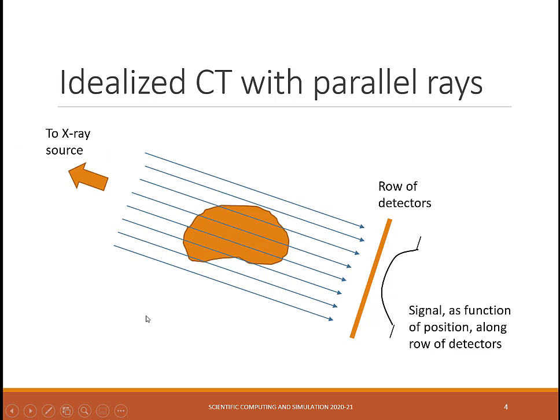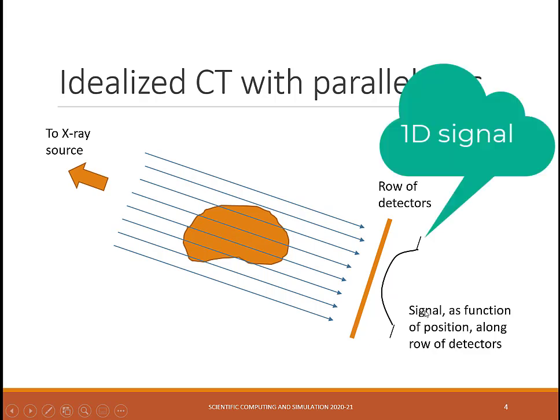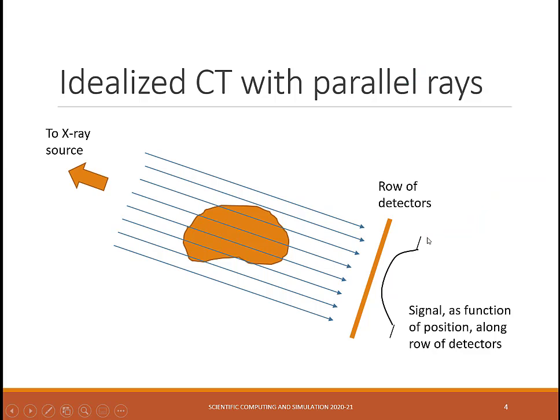It's obvious that any subject, like a body, is laid down in the middle of these two. Here, we can see that the detectors receive the raw data and create a raw signal that somehow projects a body slice. We will further discuss the output signal in the following slides.